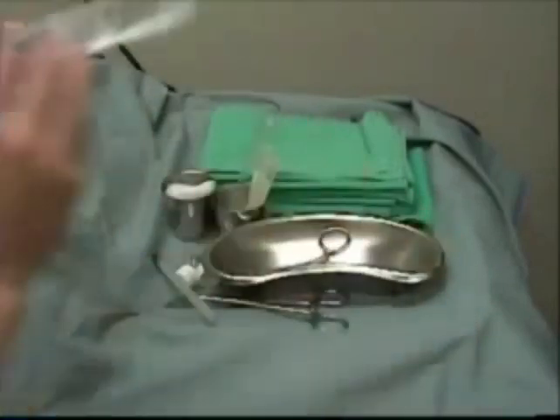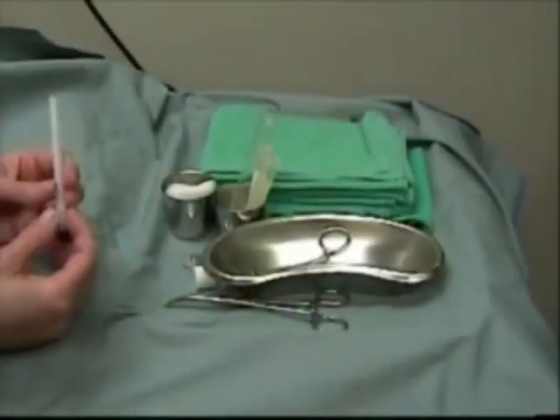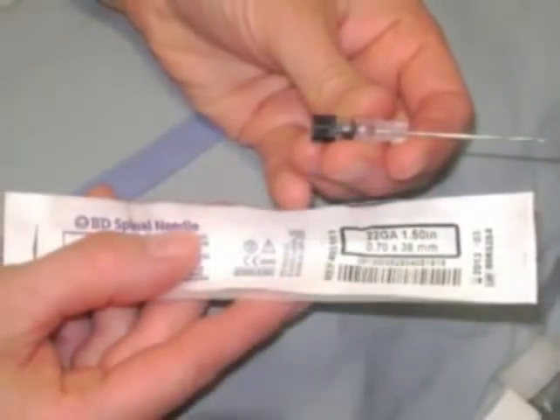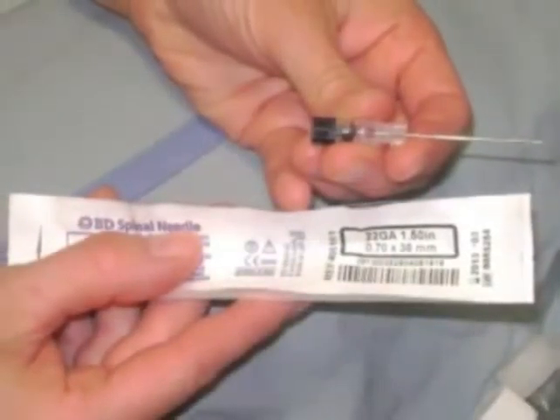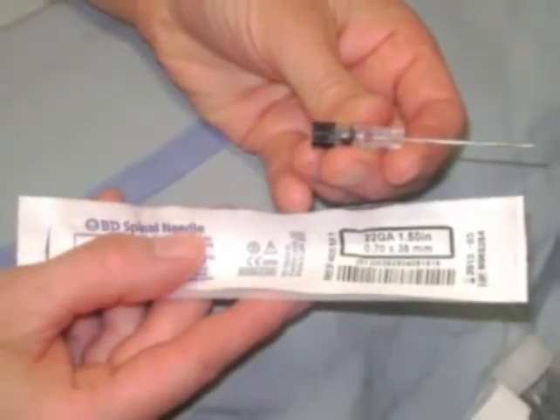Open your needle and place it on the tray. It is important to note that there is a stylet within the needle. For infants, you will typically use a 22 gauge 1.5 inch needle. Longer or larger gauge needles will be used for older children and adolescents.